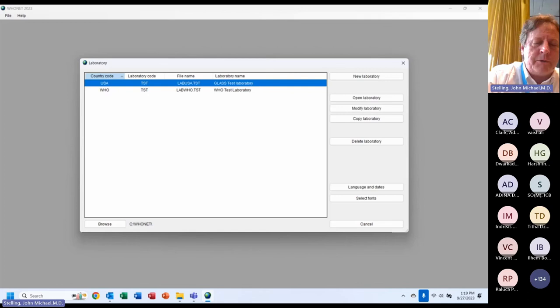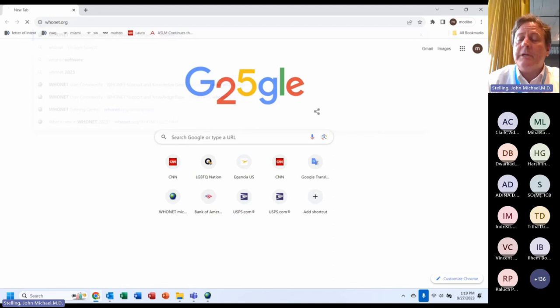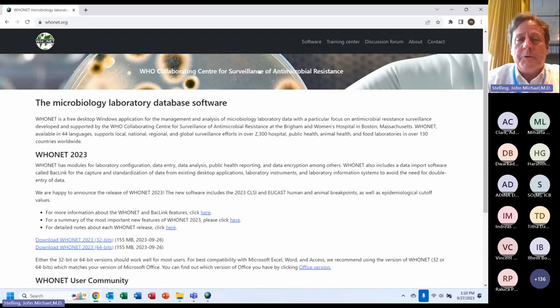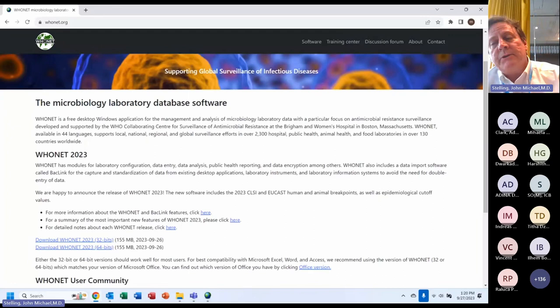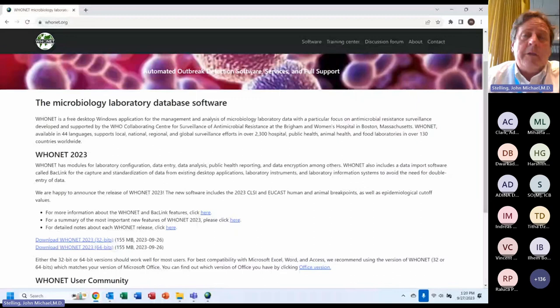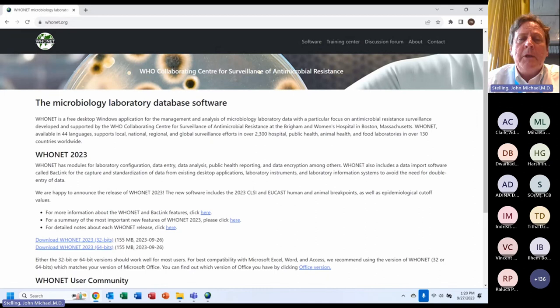I'm going to go to the WHO Net website. Some of you are extremely familiar with it and some are not. For today, I'm assuming most of you already have some familiarity with WHO Net download, installation, and data entry, and are interested in the GLASS features. The website is whonet.org. Here you can download WHO Net from the main page — the 32-bit version for older Office installations, or the 64-bit for newer versions.